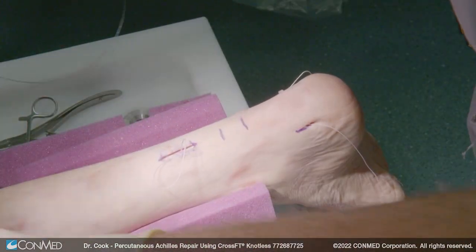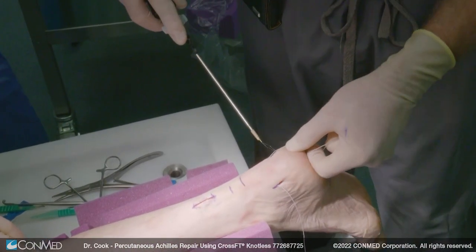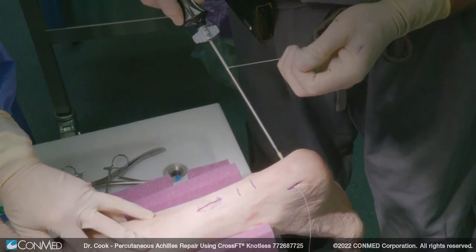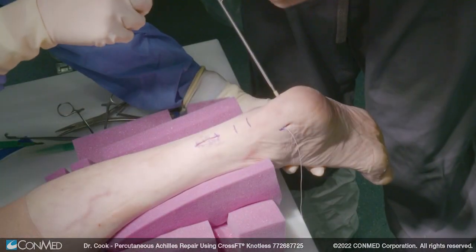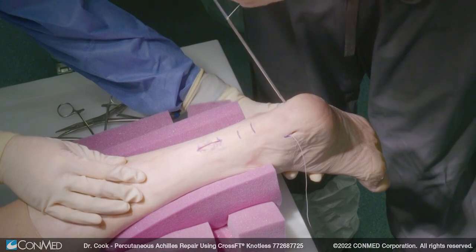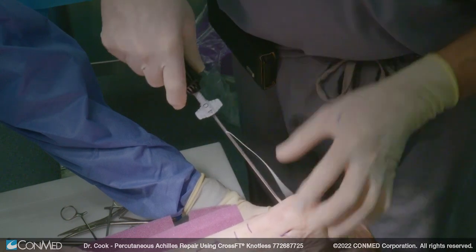So now we have the proximal with a very good tension. We're going to take the 4.0 CrossFit knotless anchor and pull the suture through this. Then, like we normally do, we're going to plantar flex the foot to pull our ends together. We're going to put this in the hole and have that tension on there — we can actually hook it if you wanted to. Then we're just going to turn and push this into the bone. Because you've used the Krakow stitch, you now have a very good repair.